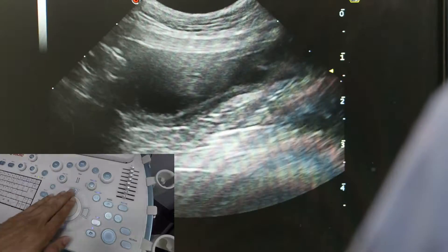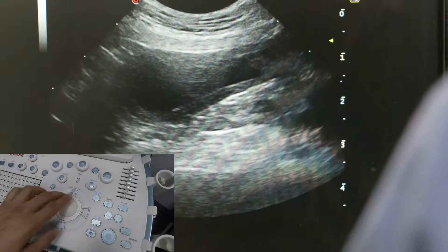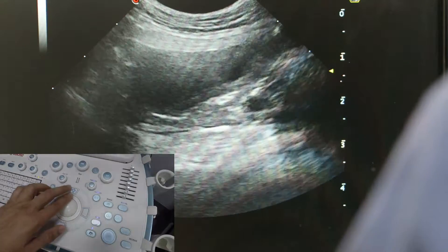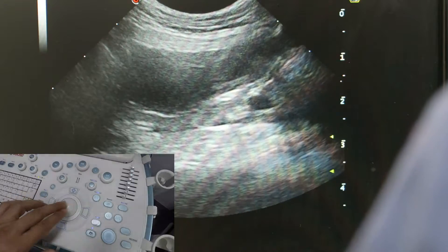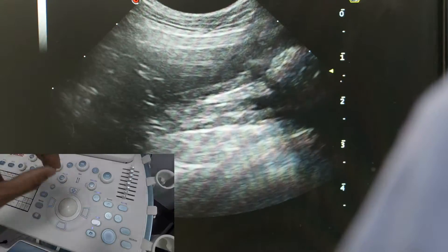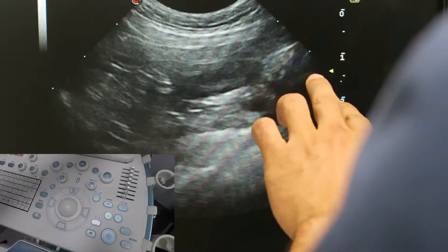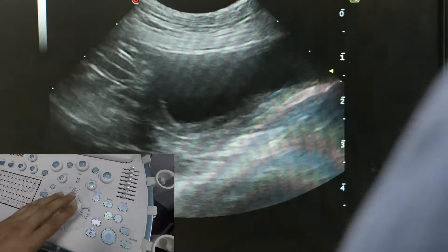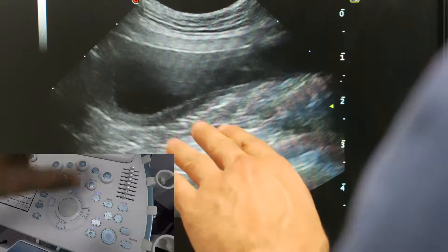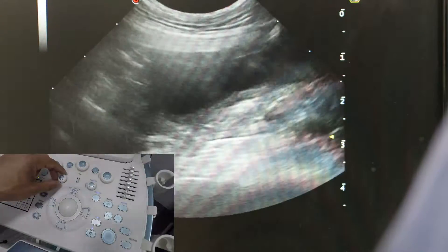The second thing is the focal point. The focal point is this dot on the side of the screen, and using the trackball you can move the focal point up and down. You can see that as we adjust the trackball the image changes, because the ultrasound adjusts the image to maximize quality at that focal point. The focal point should be at the structure you're looking at, or just below.